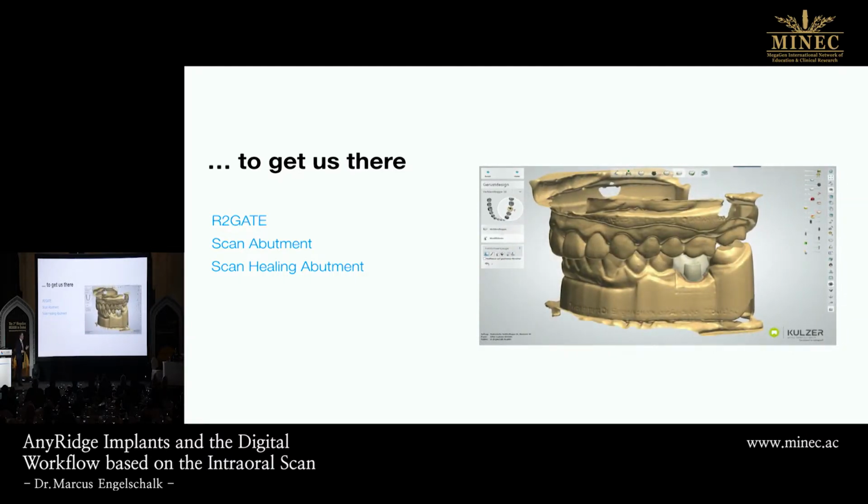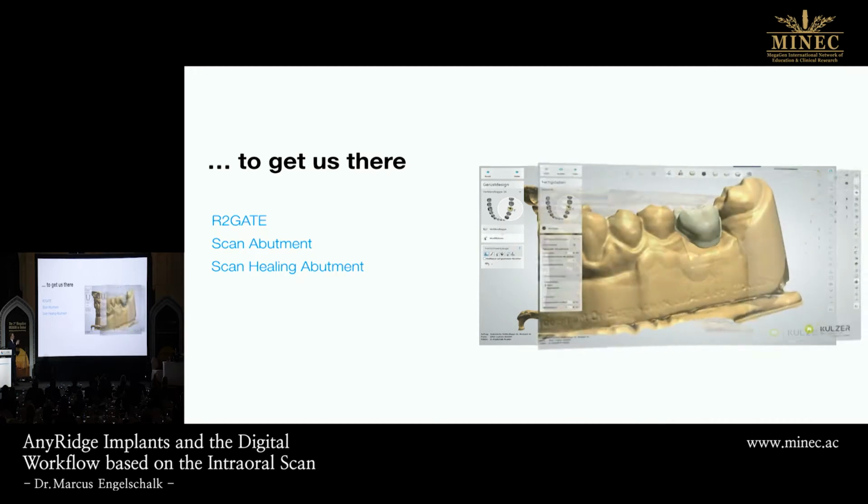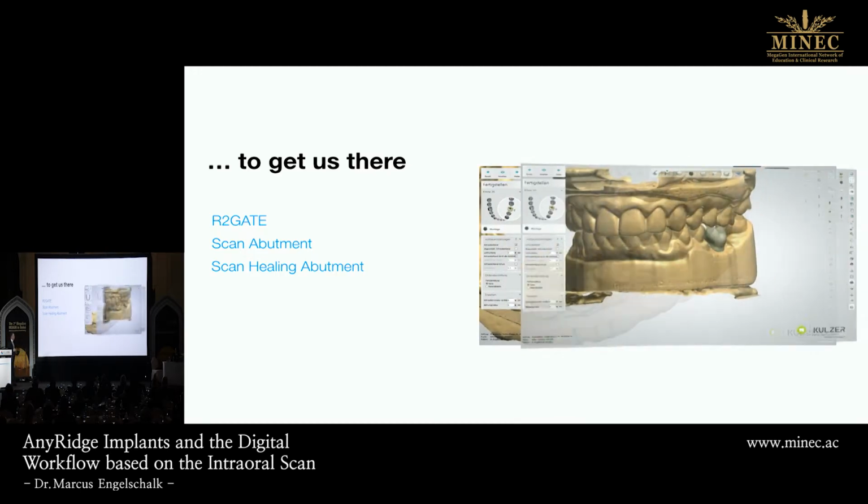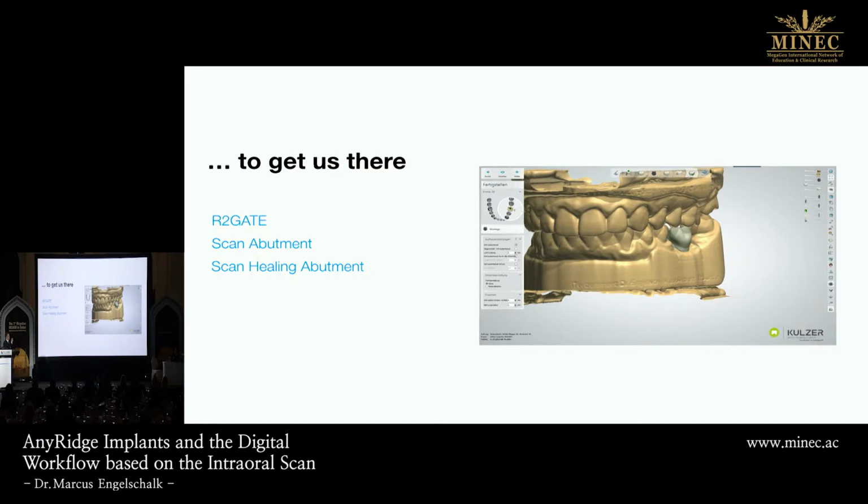So these are pictures of how a digital tooth can grow and be produced. This is only the design, it's virtual, it's not real. After this, the crown and the abutment get milled, and then it's real. But we have to plan it. And the question is, do we plan it right in front of the operation, or later?